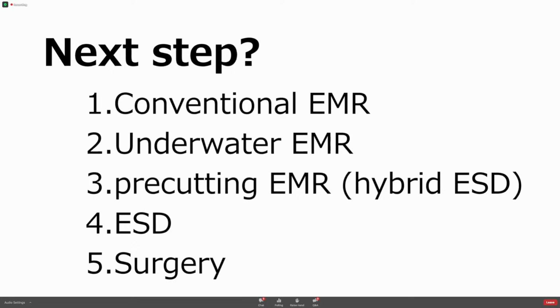The voting results show 43% chose the ESD method. Yes. And underwater and conventional EMR are similar at 20%. This is non-lifting sign positive, so we discussed that ESD was risky for this region. So we chose underwater EMR for this region. So, next.